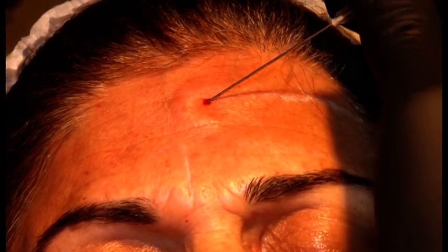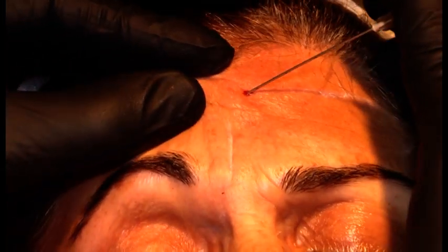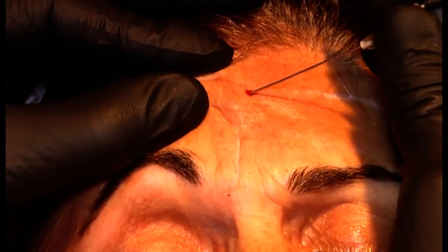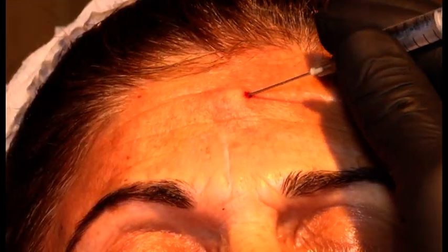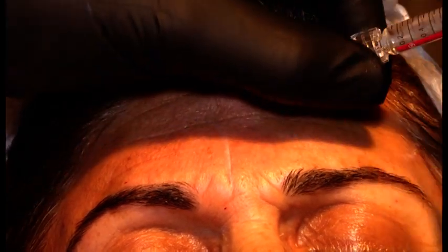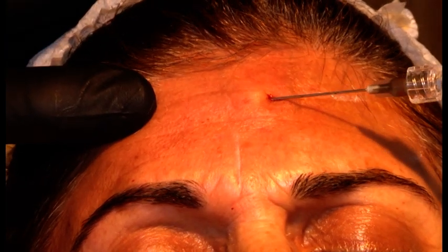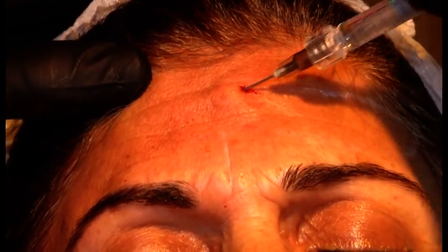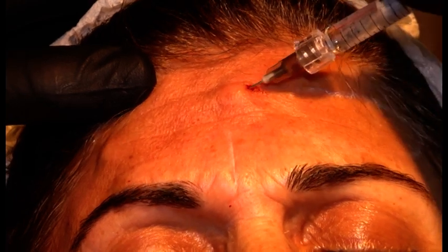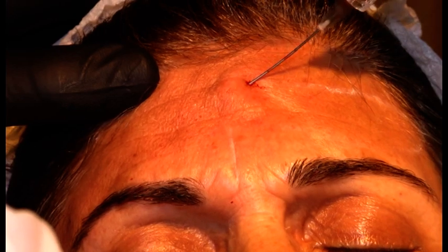All right. So, also from the medial entry point, I lift the muscle in front of the cannula, and the cannula goes through the galea, underneath it, to the periosteum. The bevel goes down, and I start injecting small retrogrades. I don't want to inject a lot of product per retrograde.